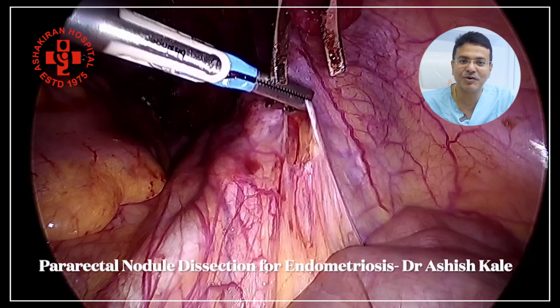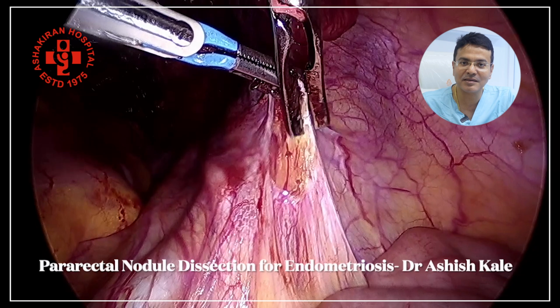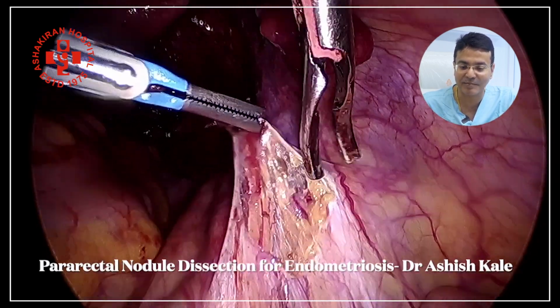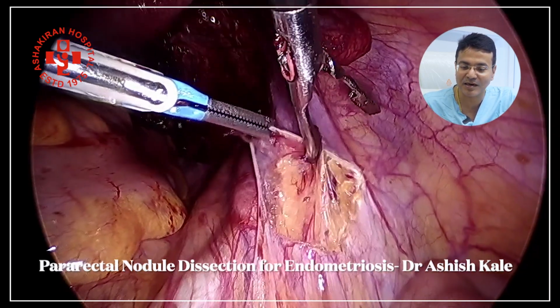Hello friends, in this video we are talking about the parametrial involvement of endometriosis. You can see the dissection is going to start with the virgin area, that is the sacrum, or maybe at the IP ligament. You can see we are using only two instruments, that is a bipolar shearer and a bipolar itself.